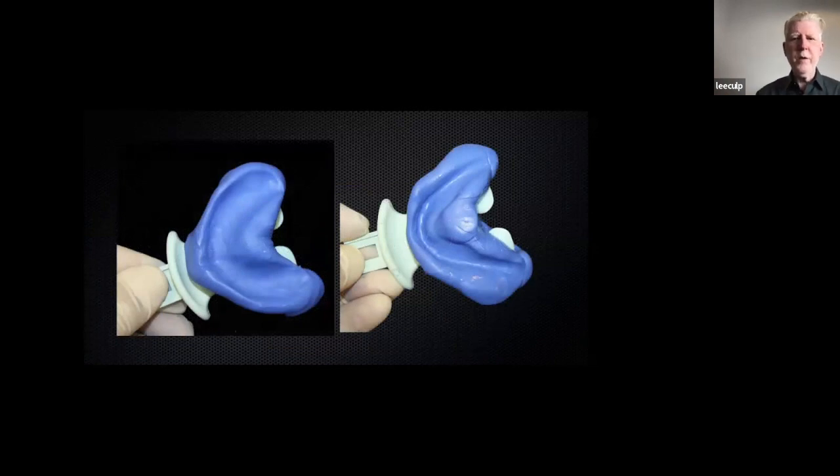So we'll go to the way Ivoclar designed it. And I've really got to be honest here. I don't do a lot of these because normally there's a denture, unless it's just horrible. You've got something you can start from that makes it a whole lot easier. But let's say you don't.